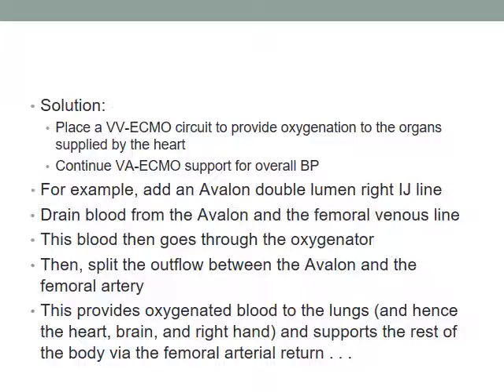So the first time we did this, we used a very sophisticated device from Home Depot. Actually, I joke, it was Lowe's. But it's one of those little clampy things, and you pump it and the clamp comes together. We had one of those, and I have a picture of that. So we used that, and it worked fine. Since then, we actually have a true little clamp that we use. But you have to clamp the outflow, or you'll have a pure VV, you won't have any VA because of the high pressure. And this works fine.